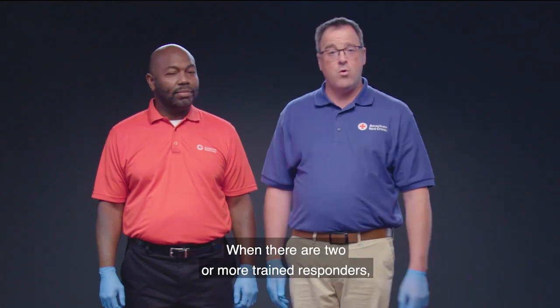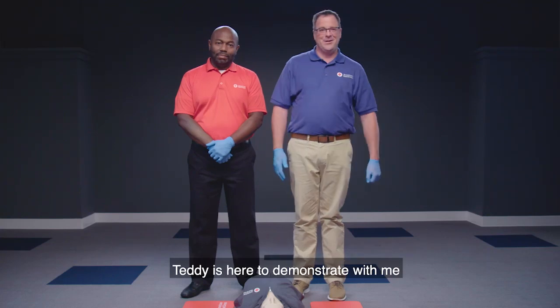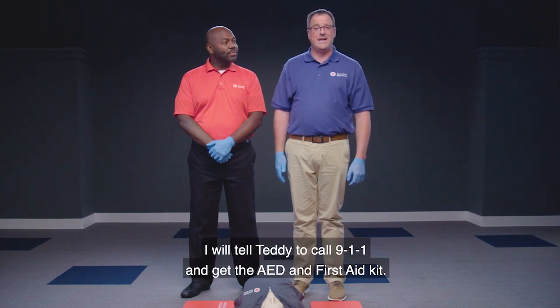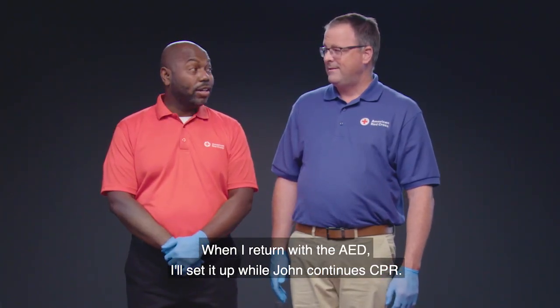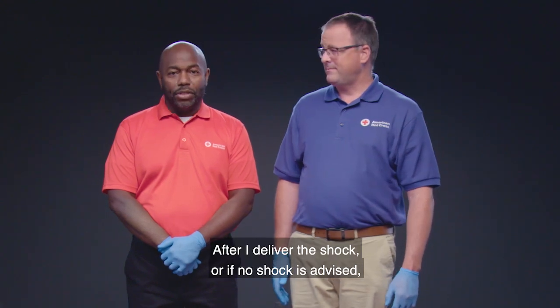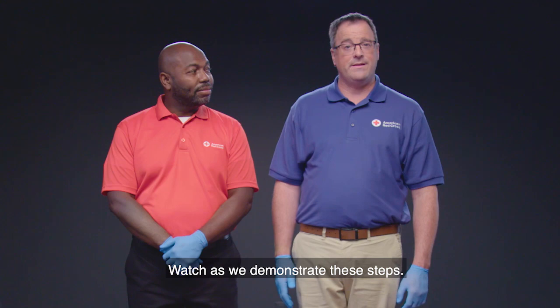When there are two or more trained responders, the steps for using an AED are the same, but one person does CPR while the other operates the AED. One responder will tell the other to call 9-1-1 and get the AED and first aid kit, then begin CPR. When the second responder returns with the AED, they set it up while the first continues CPR, without pausing CPR until the device is ready to analyze. After the shock is delivered, or if no shock is advised, the responders switch roles.